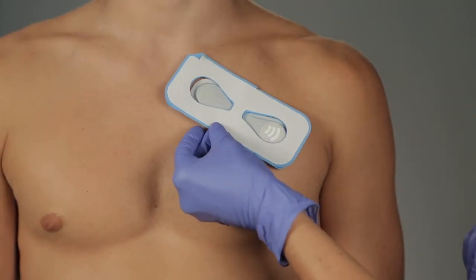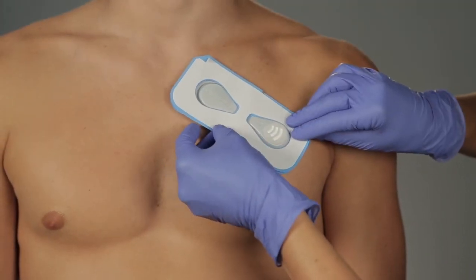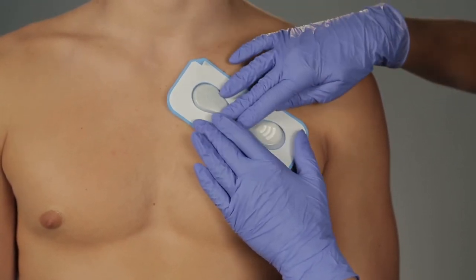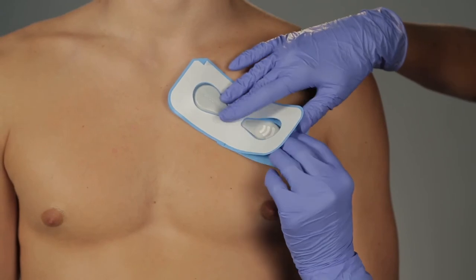Align the adhesive overlay over the biosensor with the blue release liners against the skin. Ensure the angled corner is on the side of the biosensor closest to the midline and/or centerline of the body.